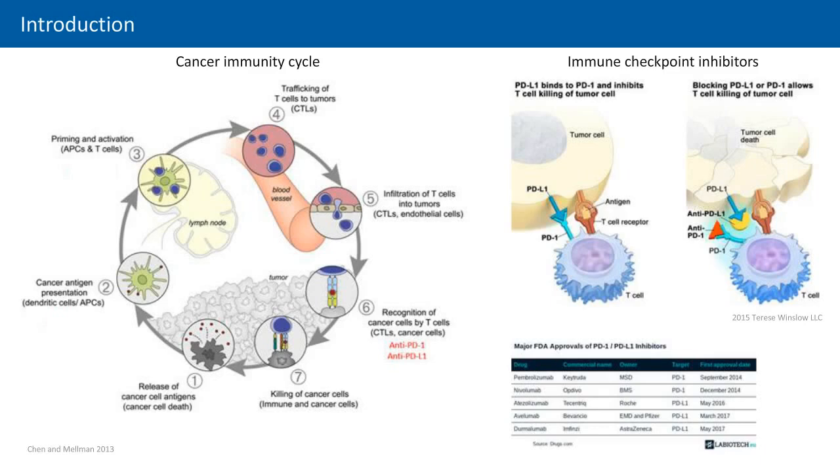Characterizing the TME for checkpoint expression with single-cell and spatial resolution may provide critical insight into new immunotherapeutic strategies and identify new predictive biomarkers for stratifying patients most likely to benefit from these immunotherapies.